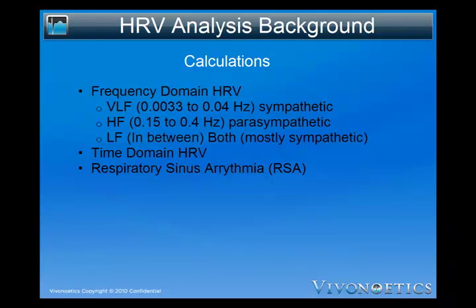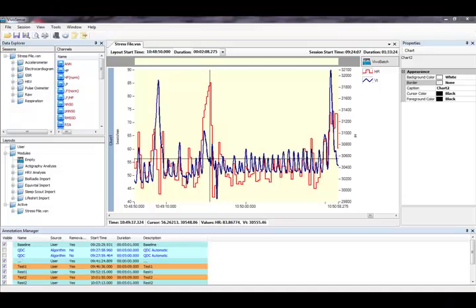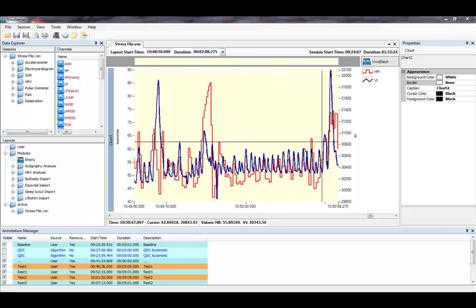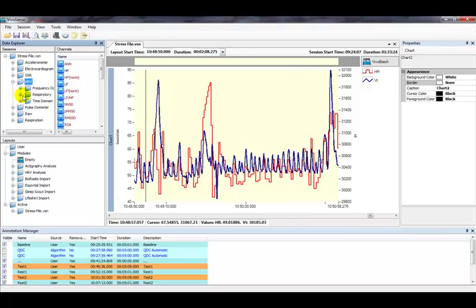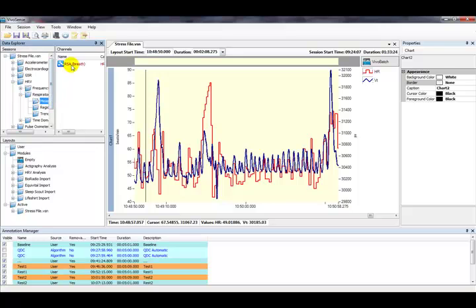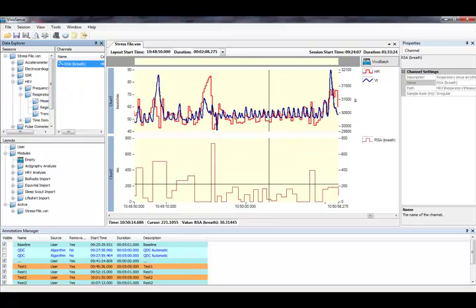Therefore, if respiration were simultaneously measured with ECG, it is possible to provide an accurate individual-specific quantification of the actual RSA. This feature is offered in VivoSense. To understand HRV respiratory channels better, let's open VivoSense and have a look at a file. Here we have opened a file with heart rate and flow volume overlaid on top of each other. Let's add the heart rate variability respiratory channel measure, RSA breath, to the synchronized chart panel here.